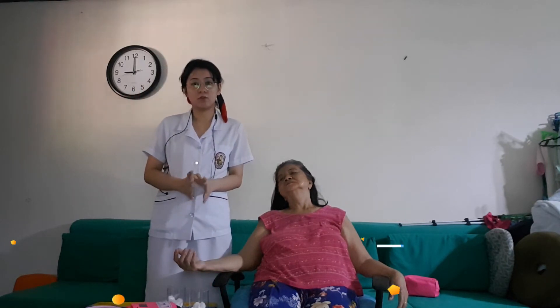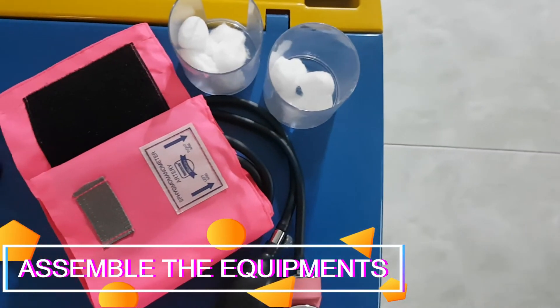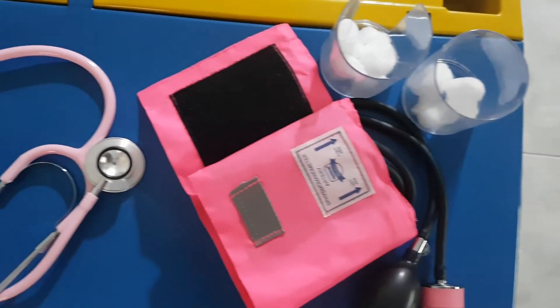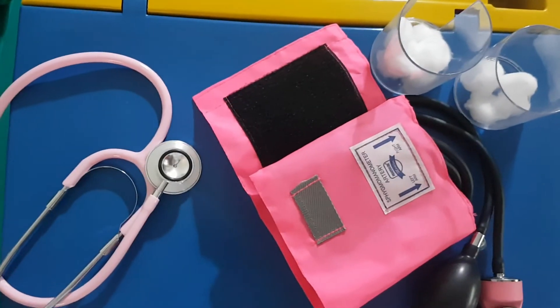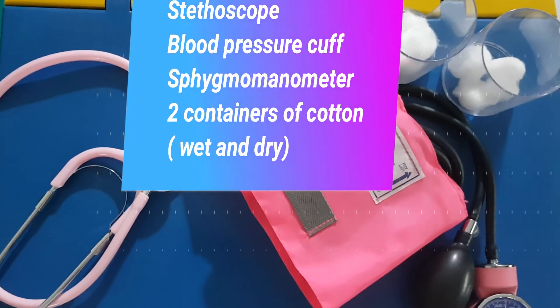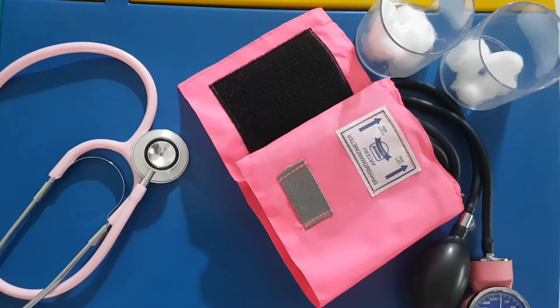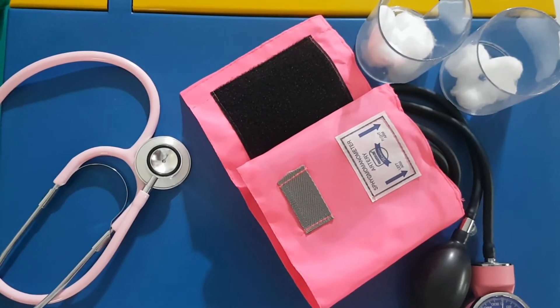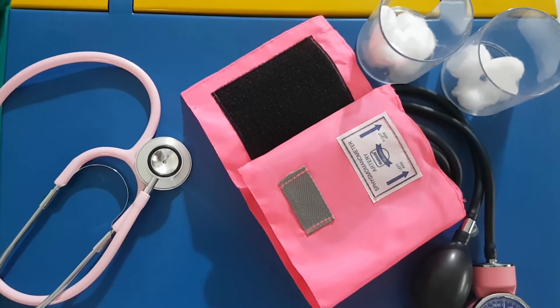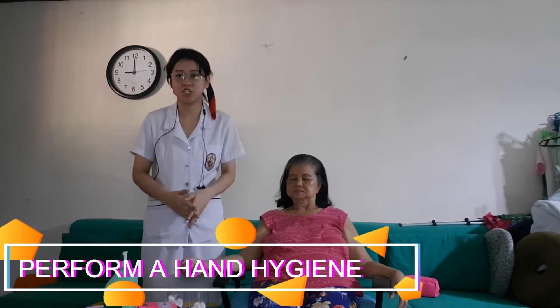Next, let's proceed with the equipment. For assembling the equipment, I have here the stethoscope, the blood pressure cuff, sphygmomanometer, and also two containers containing wet and dry cotton balls. Next, we have to do hand hygiene before performing any procedure.